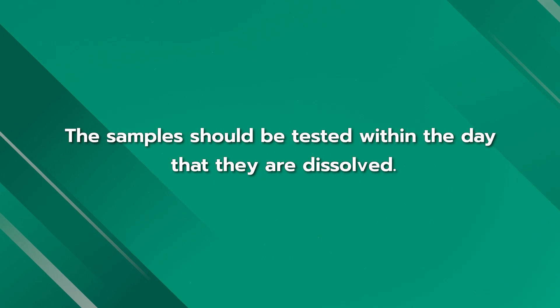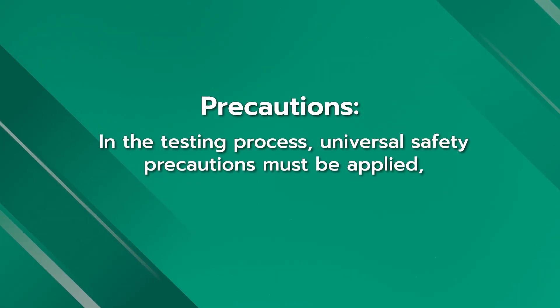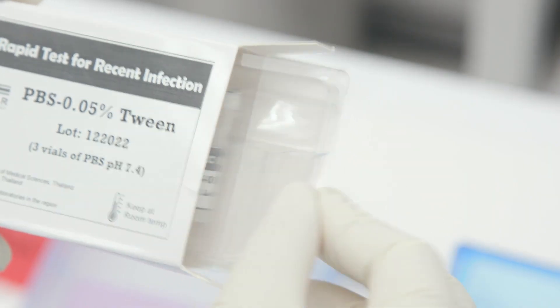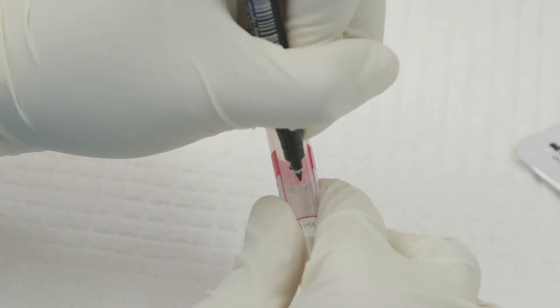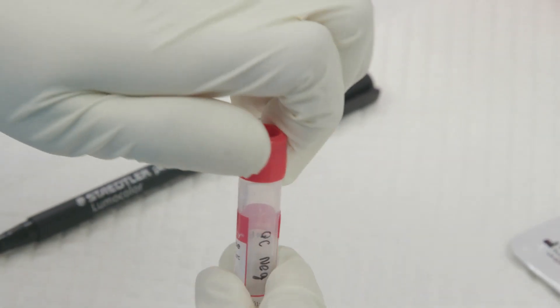During the testing process, universal safety precautions must be applied and the test area must be kept clean and tidy. Step 1: Collect test items from the test kit and assemble other accessories. Step 2: Label the patient or specimen ID number on the sample buffer tube, remove the lid, and discard it into a biohazard bag.